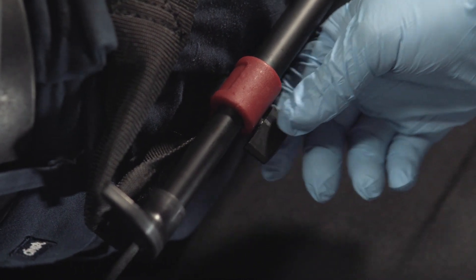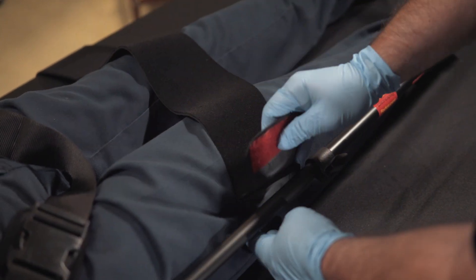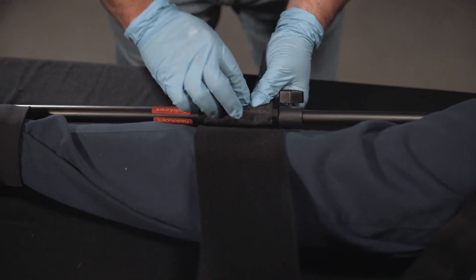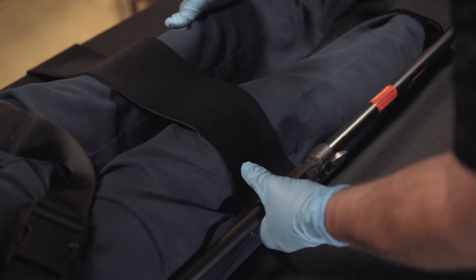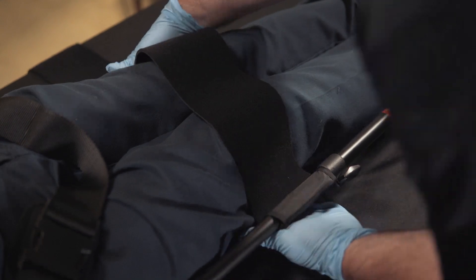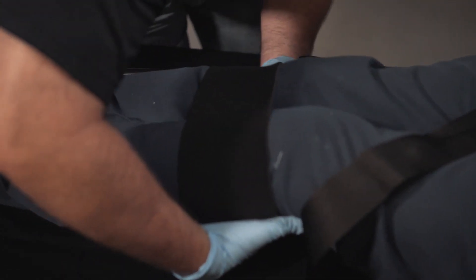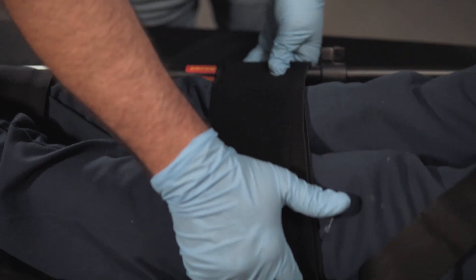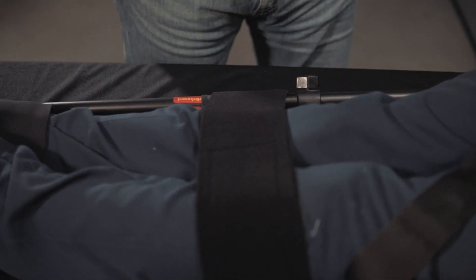The last thing we can apply is a mid-leg strap. This goes around the middle of the device, and what it will do is help secure and bind the legs together to help restrict lateral movement. This is not required to help maintain traction on the leg. Make use of that natural gap created under the legs, come around, and fasten it back down. All that's going to do is limit the lateral rotation — it's not required to maintain and achieve traction.